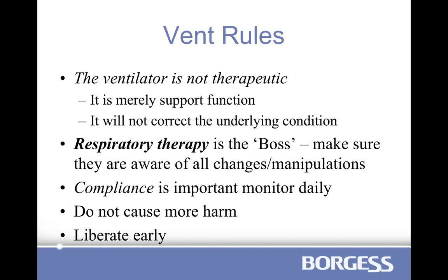So I like to consider the vent rules. The vent rules are: the vent is not therapeutic. It does not cure the disease. What the vent does is it supports underlying function. So just make sure that you understand that concept because the vent does not fix the problem.